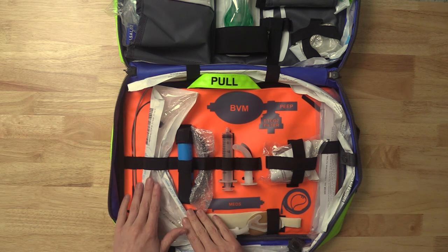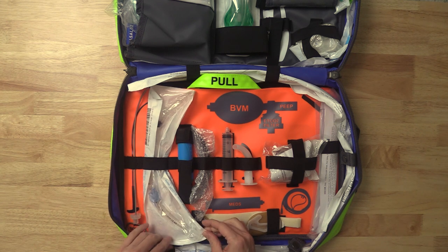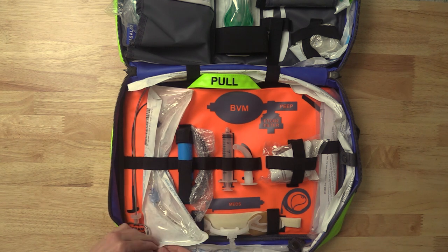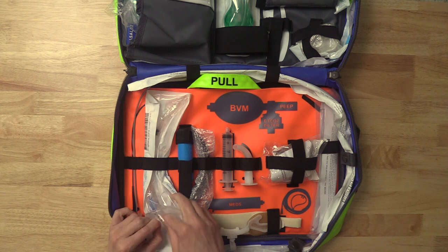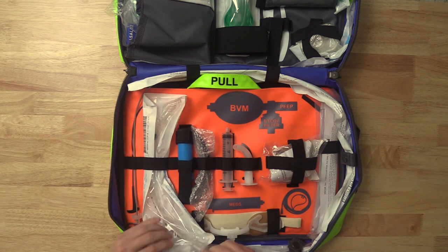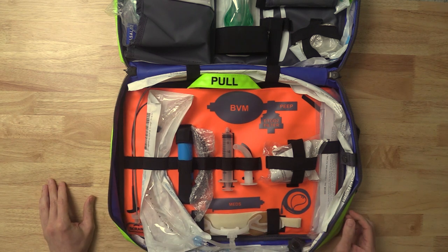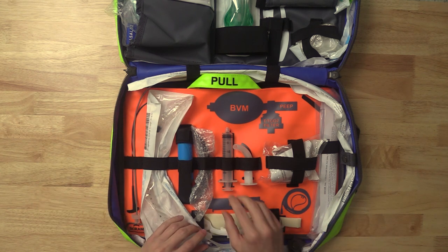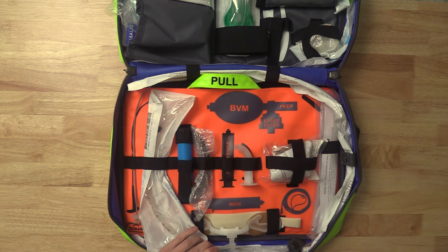I'm showing you the way the Joint Commission people would like to see this, but you could absolutely — and oftentimes I do with this bag — open up the ET tube from the top, grab out your tubing, and just let it sit like that. If you intubate frequently, that's a great way to go, because when you're ready to set for the intubation you're just going to grab your syringe, pop it on, check, and you're good to go. So that's up to you how you want to store it.